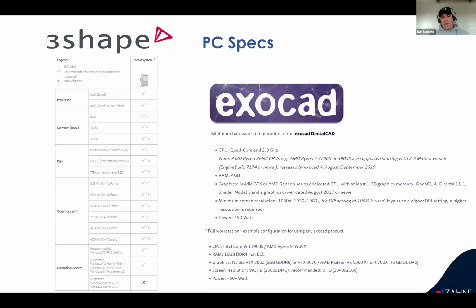But I put it up there because I do see a lot of people bringing it up, and just the thought of how much to spend on a computer. exocad generally is considered to be a little bit quicker. I had an old 4 series i7 that ran version 3.0 just fine, never even knew. And then 3Shape, and we were upgrading our computer.